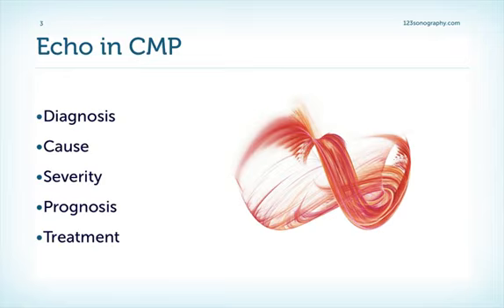When you perform echocardiography in patients with dilated cardiomyopathy, try to put yourself in the driving seat of the referring physician. Try to answer the question as to what is the true diagnosis of the patient. Does he really have dilated cardiomyopathy? What is the cause of the disease? How severely is the patient really affected? What is his prognosis, and can you get clues as to how to treat the patient or how to optimize medical therapy?